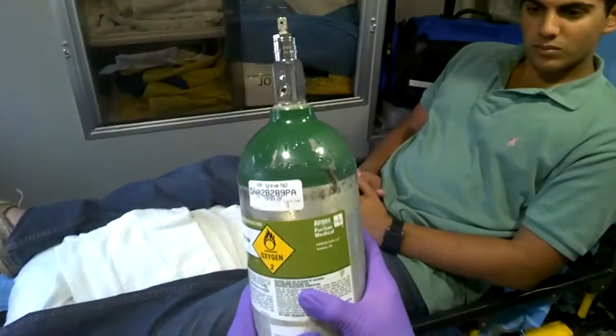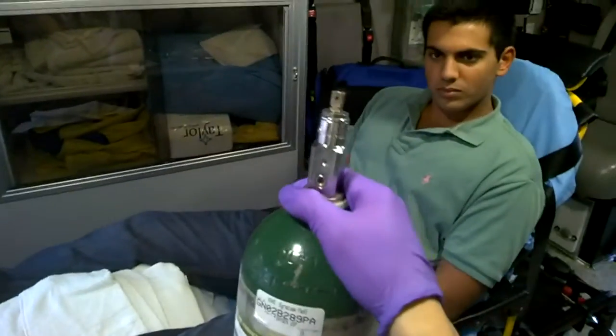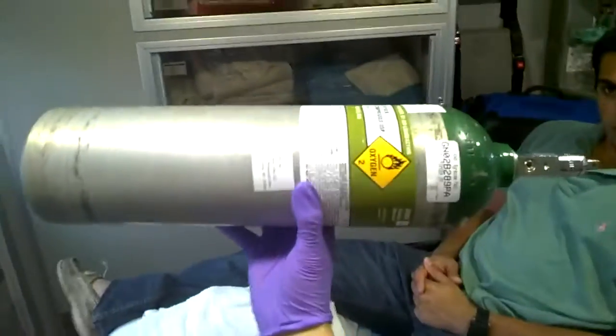Now, the first thing we need to know about giving oxygen is to secure the oxygen tank. So you never want to leave it standing up, but you can leave it horizontally to the floor or on the ground, or usually just strap it in the back of the stretcher here.